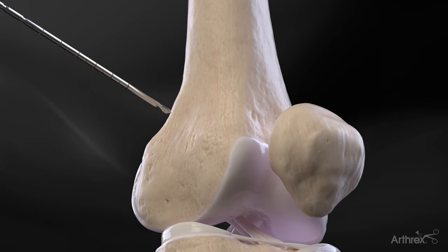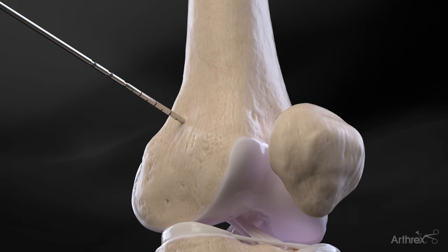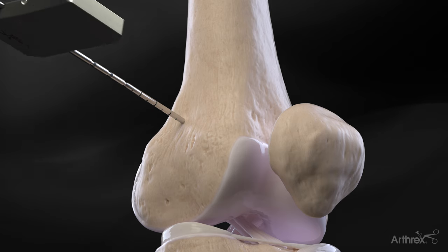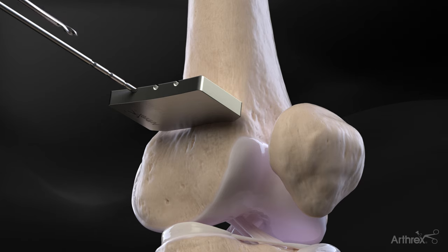A 2.4 mm breakaway osteotomy guide pin is placed under fluoroscopic control approximately 15 mm proximal to the femoral trochlea, angled obliquely toward the medial epicondyle. An optional second pin may be placed using the parallel cutting guide under fluoroscopic control to preserve slope.